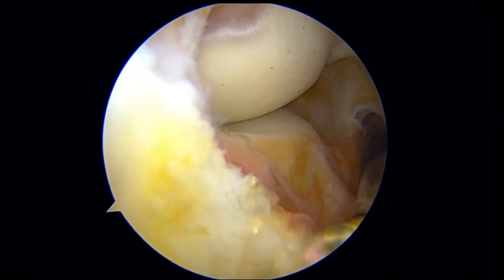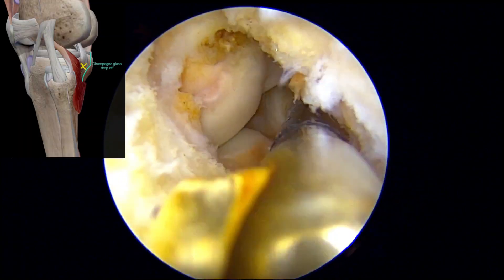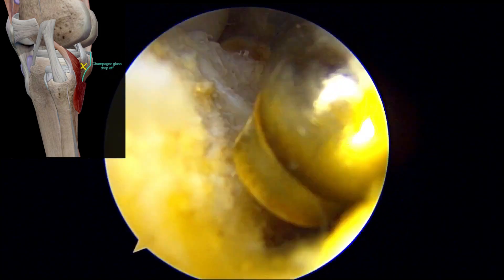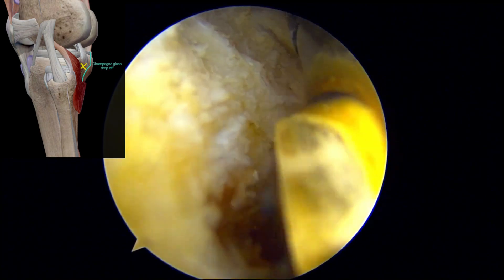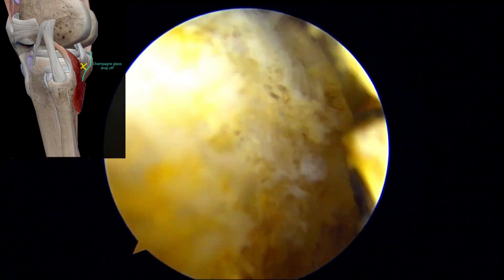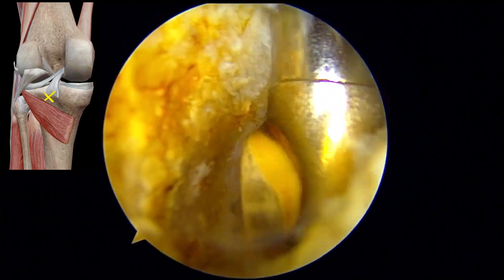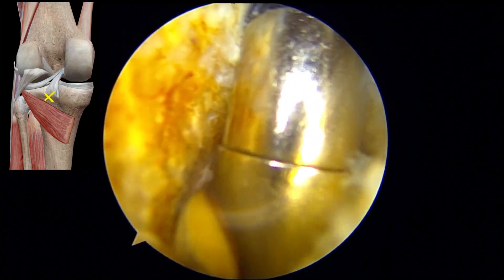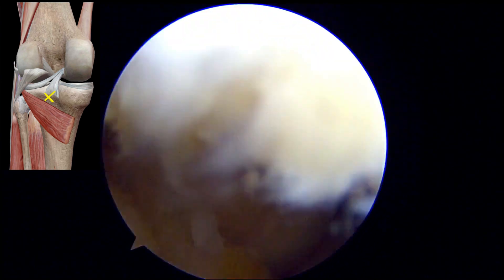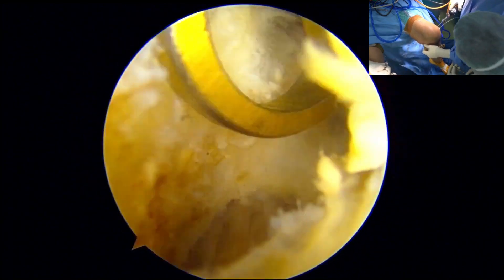Once the septum is cleaned, the identification of the footprint begins, starting from the remnant and moving distally. Two landmarks are identified: the champagne glass drop-off and the popliteus muscle. The next step is to identify the superior portion of the popliteus muscle. The ideal tibial footprint is located just above the popliteus muscle, ensuring that our PCL reconstruction has a hooking effect on the tibia to prevent posterior translation.